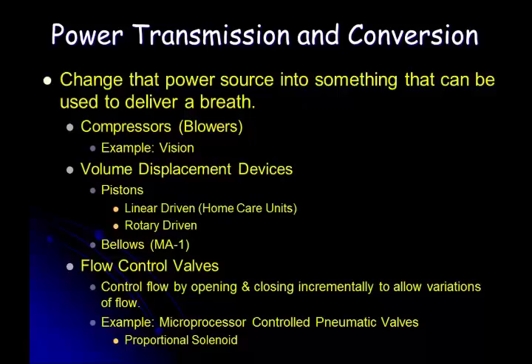There could also be a bellows internally. When we get in the lab, I'll pull the back off of my favorite ventilator I have there, the Puritan Bennett MA1. And you could see the internal bellows that are there, just like you would have with Julia Roberts.